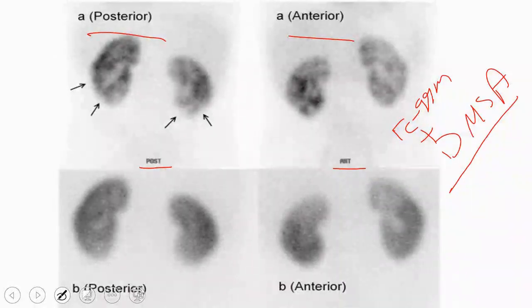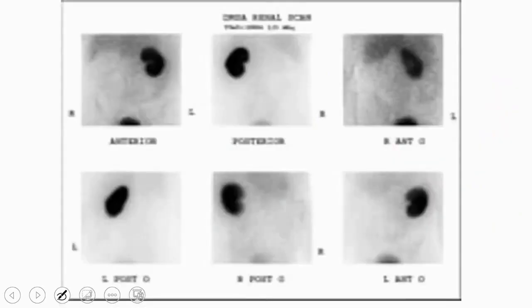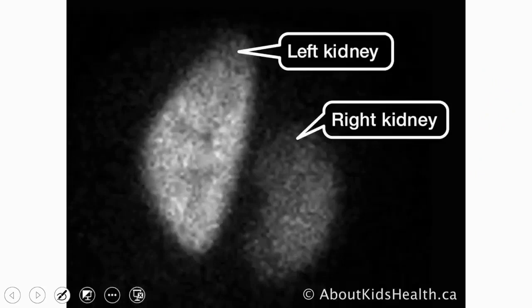You detect the photons coming in. For example, this image takes about 5 minutes, and every minute you perform a certain count. This count is then translated into an image. In summary, the work we've discussed doesn't have any issues. For me, this story is like, for example, this image here. Notice that the background is black. This is the original image, not the inverted one.